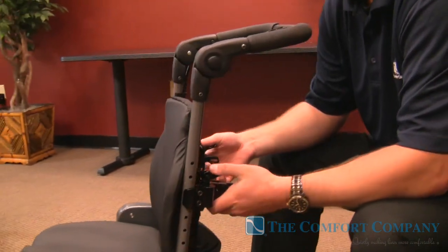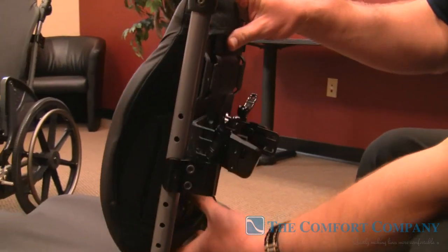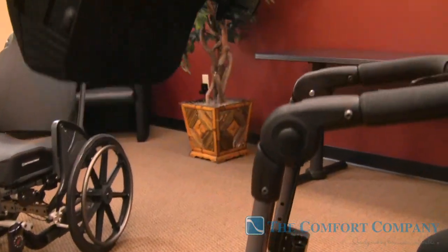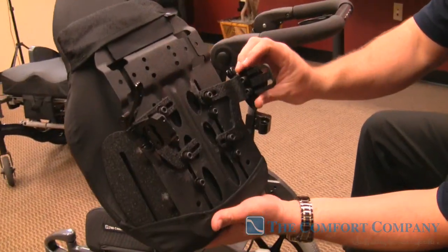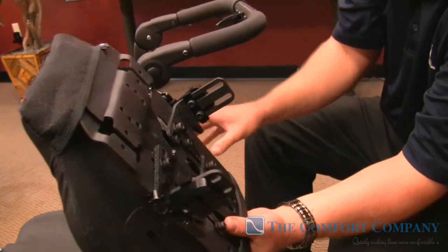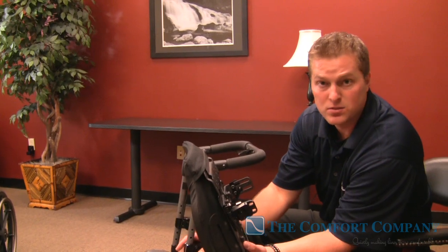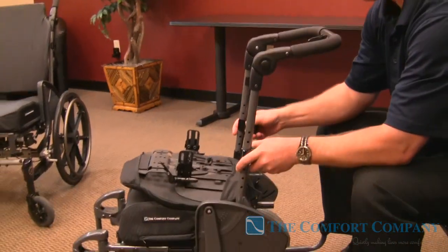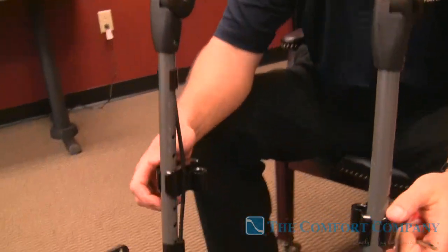What I have here is a 12-inch Embrace system and I have every single bolt on here loosened up. I can't stress the importance enough of this: when you have everything loose on the system, how it actually fits into the receiver is going to give you a home run every single time if you follow these simple steps to get the back onto the wheelchair.